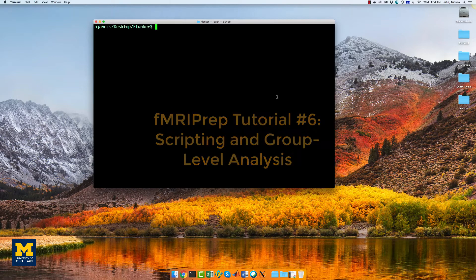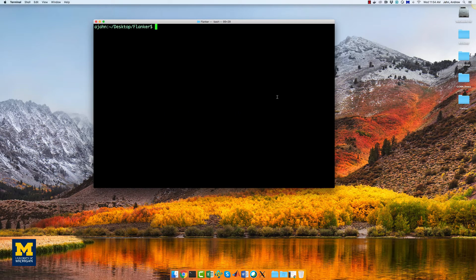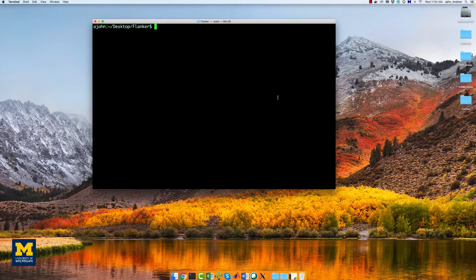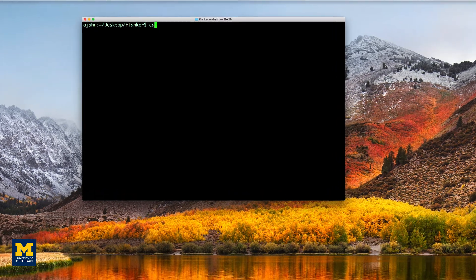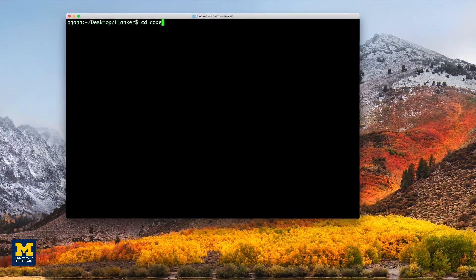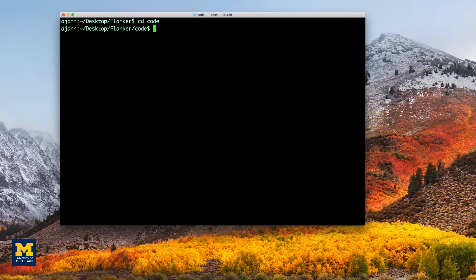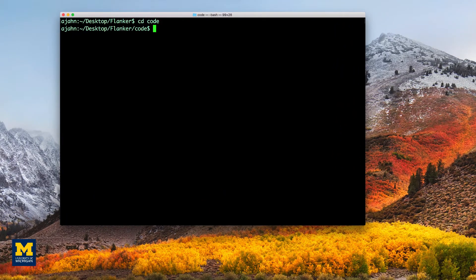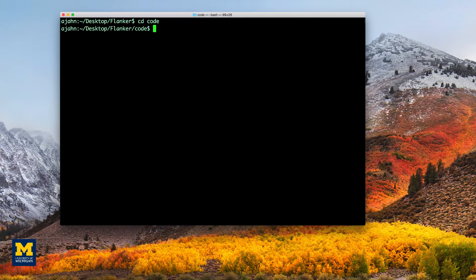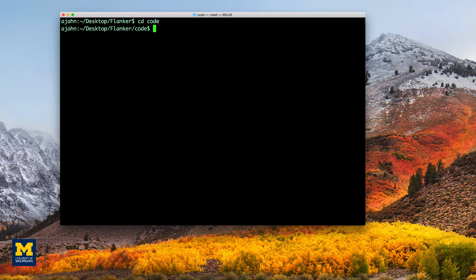Previously, we used the fMRI prep single subject script that had a hard-coded subject number. To put this code into a for loop, we will need to include this line of code just below the first line.